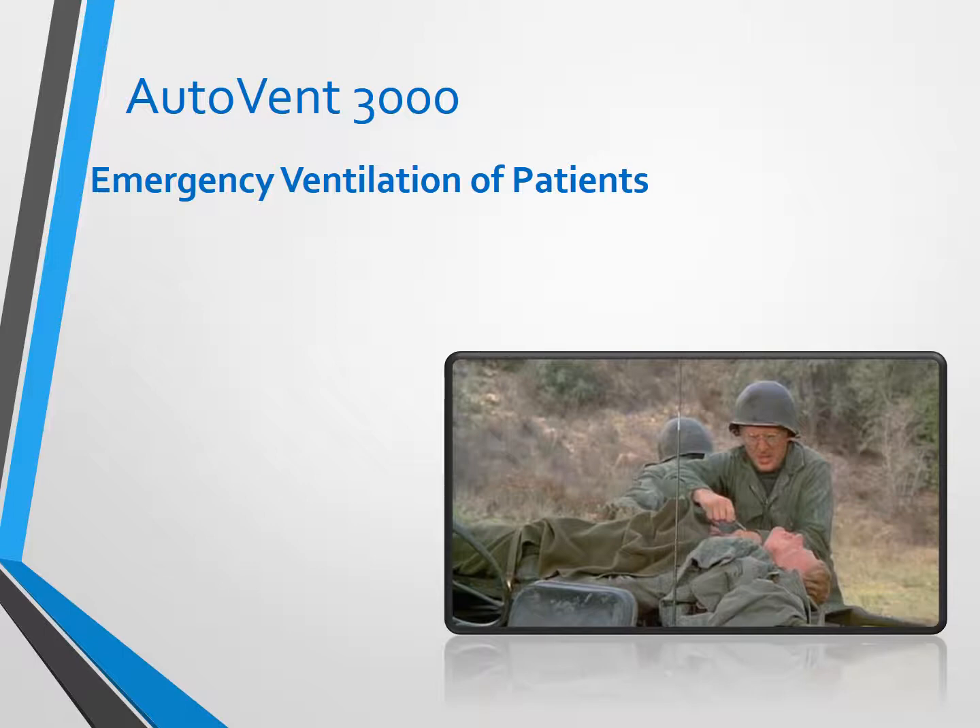The most probable scenario for deploying this is that the patient is going to need some sort of emergency ventilation. This patient's not normally on a respirator, but something bad has happened and you've determined that — because you don't have enough humans to assist, because of the nature of the injuries, or because of the transport involved — you're going to need to put this patient on the AutoVent 3000.